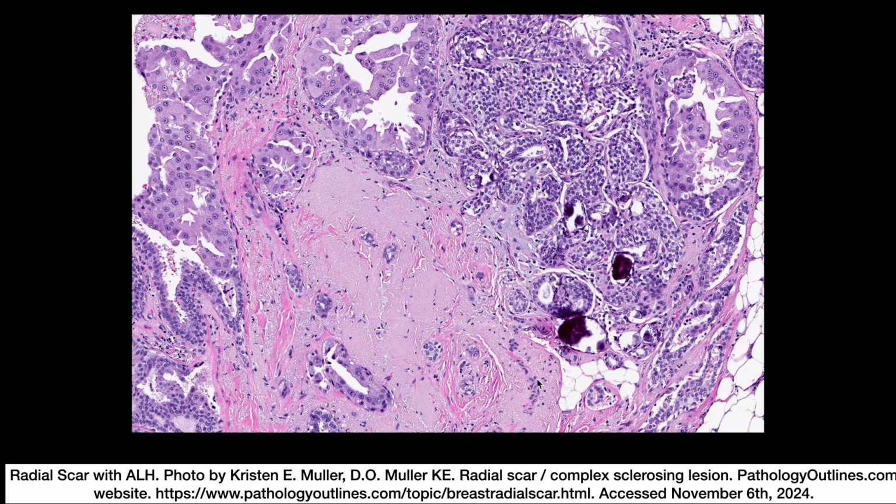This is a radial scar at higher power with atypical lobular hyperplasia, where you can see some clearing of the cytoplasm, some cellular discohesion, and a little bit of expansion of the lobules in this background of fibroelastosis. And what you see here, although it looks scarier, is less concerning than this ALH. It's just apocrine metaplasia, which can have this apocrine atypia with enlarged nuclei and nucleoli, but the nuclear cytoplasmic ratio is the same.